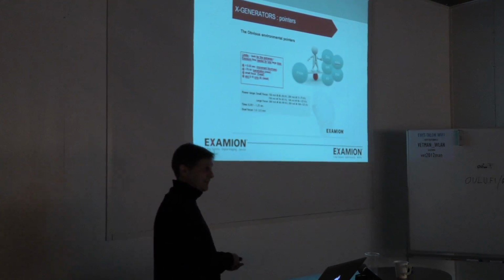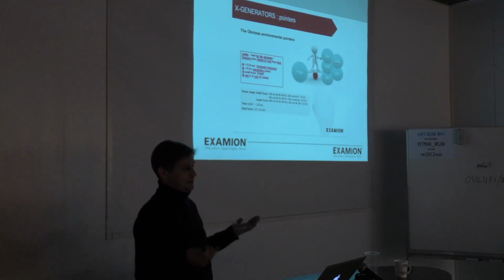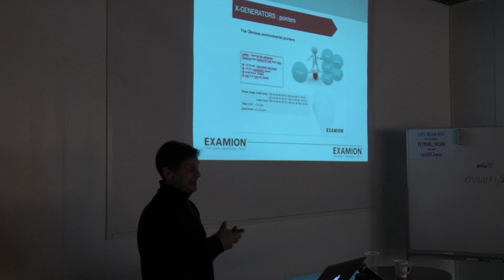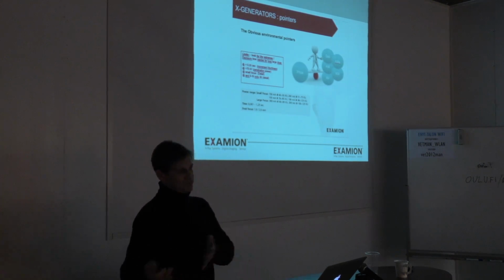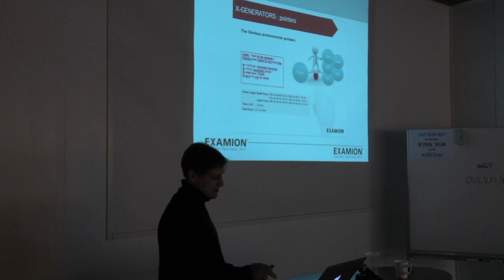The companies who manufacture the X-ray machines do not always want to tell you, also because there are, I wouldn't say a million, but thousands and thousands of X-ray machines and X-ray tubes on the market, and sometimes it's very difficult to find out which type has been built in which machine. Okay, so in the end, when you buy the machine, have it installed and start using it, then you will find out. But sometimes that's too late. So it's always interesting to try to find out and get a good answer on it.